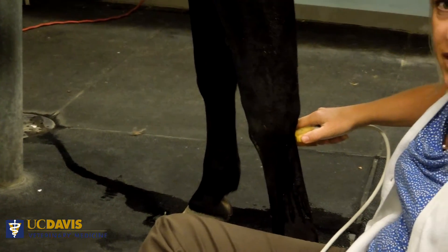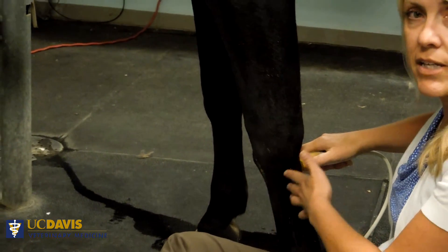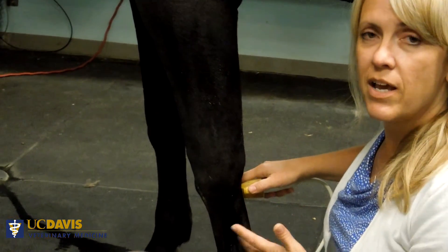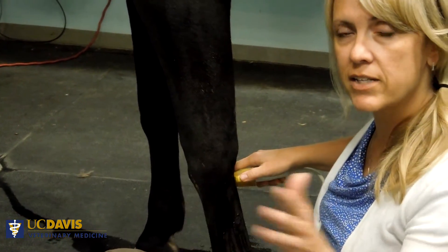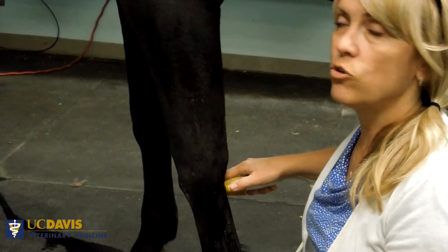I'm not pulling the standoff back onto the transducer, and I'm allowing my index finger to maintain contact with him. It's especially important — he's waking up a little bit — I don't want to get stepped on. I want to know that he's either going to step forward or he's leaning, and so on. So I have that contact, even though I would be looking at the ultrasound screen.